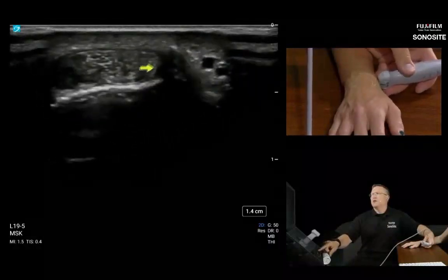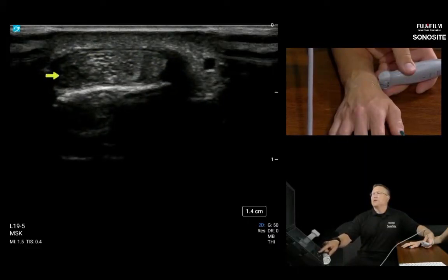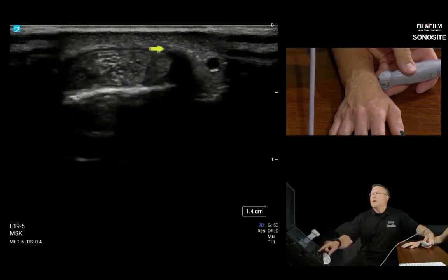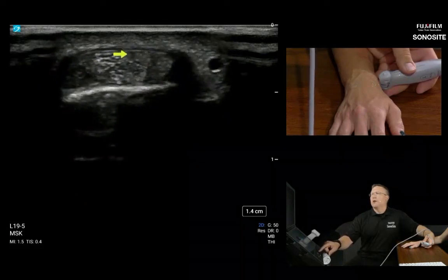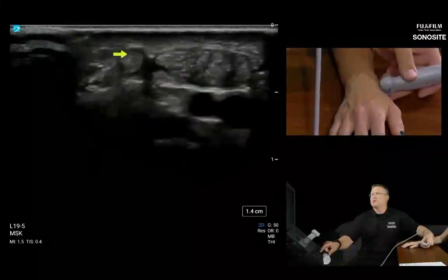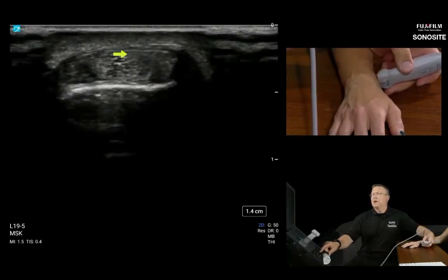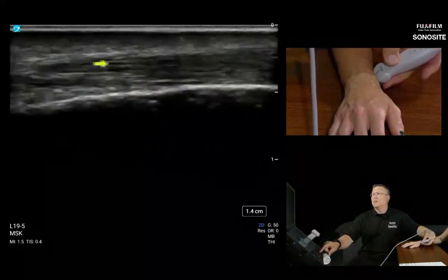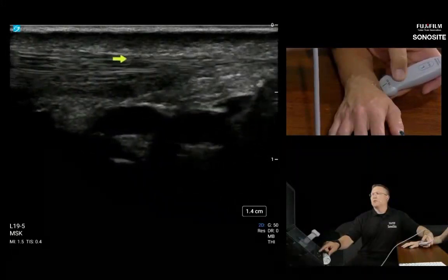And the shadows are caused by anisotropy. They're little ligaments holding the tendon down. These are little pulleys, almost like in the flexor tendon of the hand, holding these tendons down, and there's not a lot of room for fluid to collect. So that's why it's important to trace proximally or distally to look for fluid collections, but not within the retinaculum area itself. So when I go long axis, I'm going to focus on proximal or distal to the retinaculum, looking for those fluid collections.